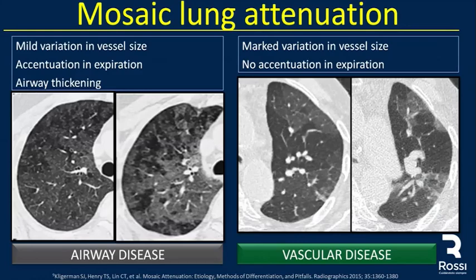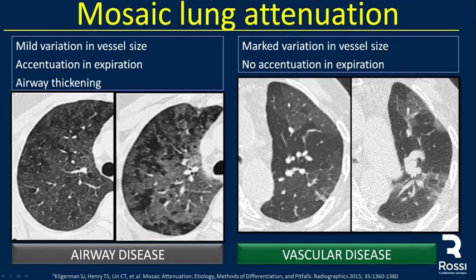Mosaic lung attenuation has two main causes, and the most common is airway disease. In an inspiratory CT we see patchy areas of low and high attenuation — a mosaic lung attenuation pattern. When we perform the expiratory CT, we see areas of air trapping with diminished vascularity. Key descriptors include mild variation in vessel size, accentuation in expiration, and some airway thickening.